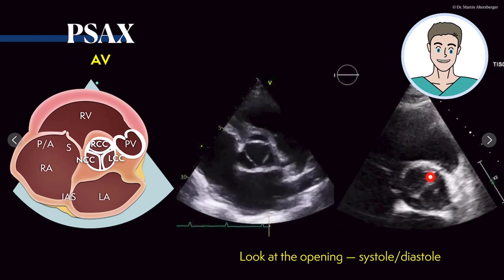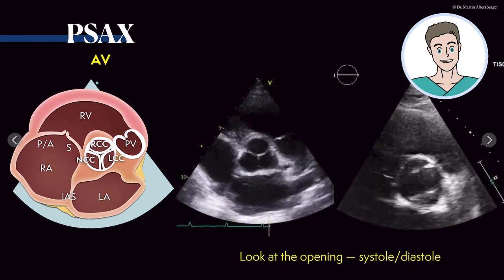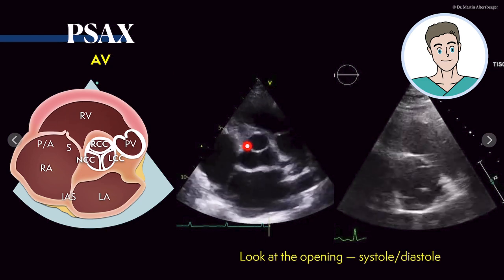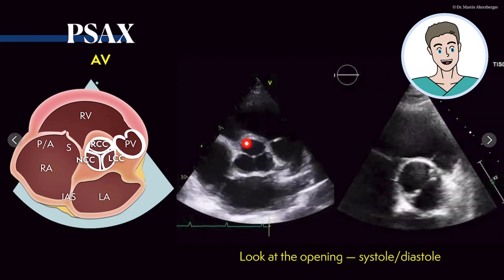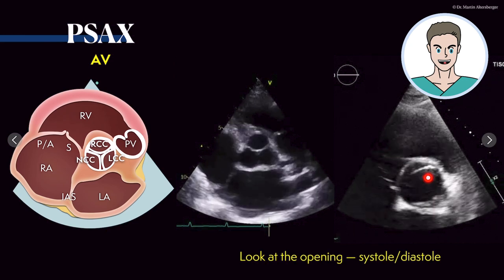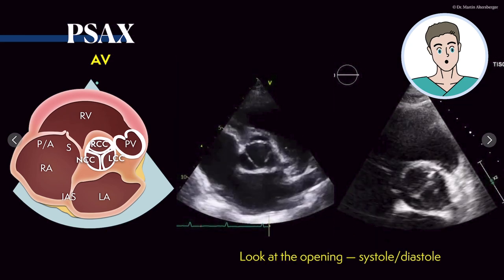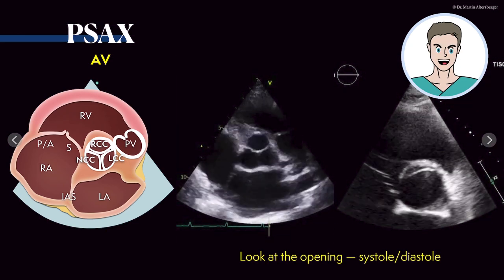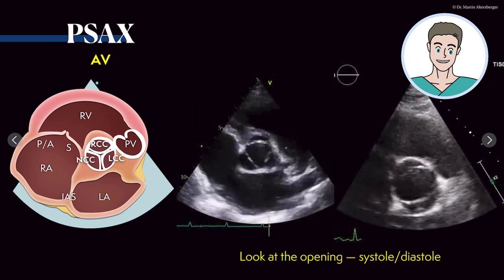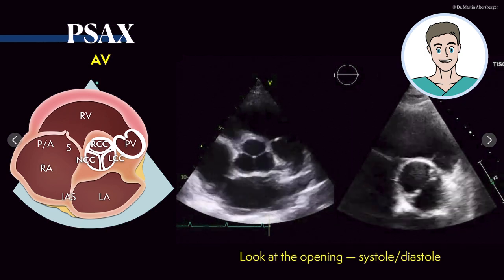It opens quite nicely, but there's a difference in the morphology. This is a tricuspid valve — the aortic valve is normally tricuspid. Here you only have two cusps, so there's one missing. This is a so-called bicuspid aortic valve. Very importantly, look at the opening and the closure — so systole and diastole.